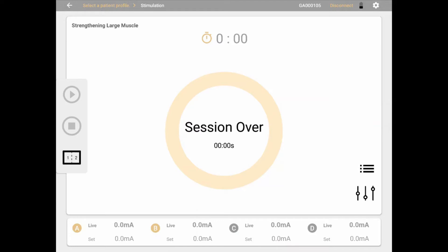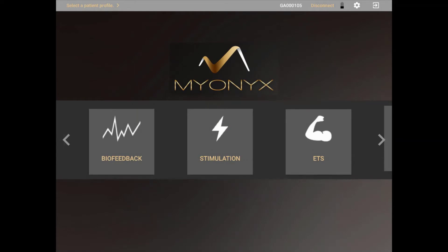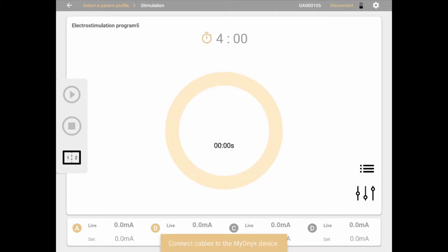To run an electrostimulation session using the Mionics app, first load the app and log in with your unique name and password. Enter electrostimulation by clicking the stimulation button in the main menu. This will lead to the electrostimulation main screen, where you can select and adjust the electrostimulation program.